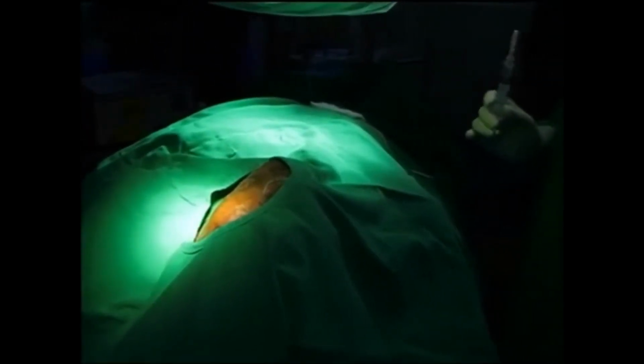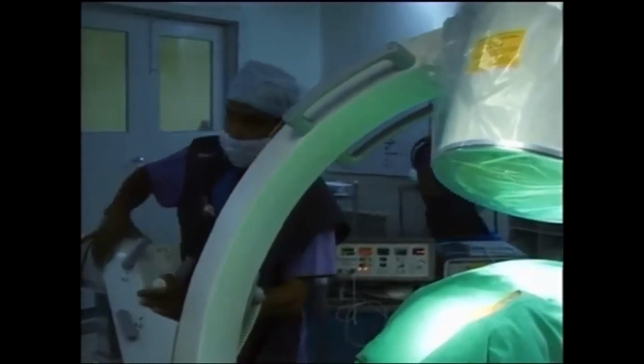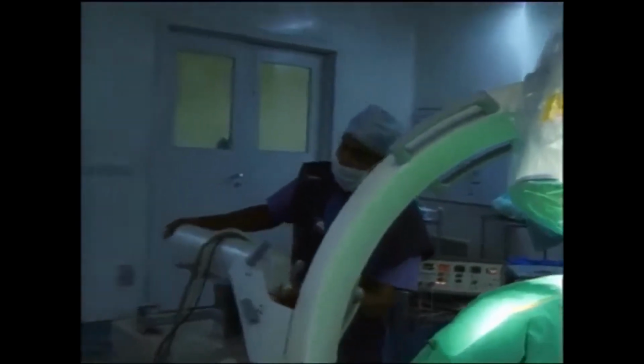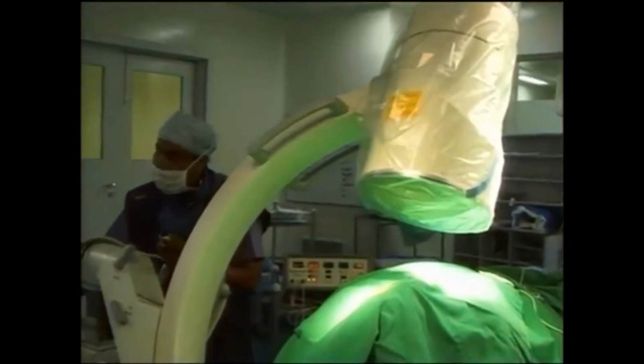Are you having a fluoro PIP? No. Can you shoot first, please? Okay, this one is going to be very easy. Can you see the foramen ovale? Show the screen. Can you focus on the screen, please? PIP is not working?